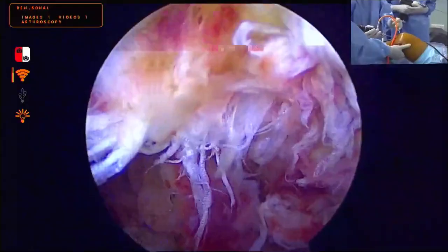Okay? Slight flexion, not too much. Slight flexion. Slight, not in a hurry. Done, that's it. That's enough. So this is almost good, I think. Go ahead.